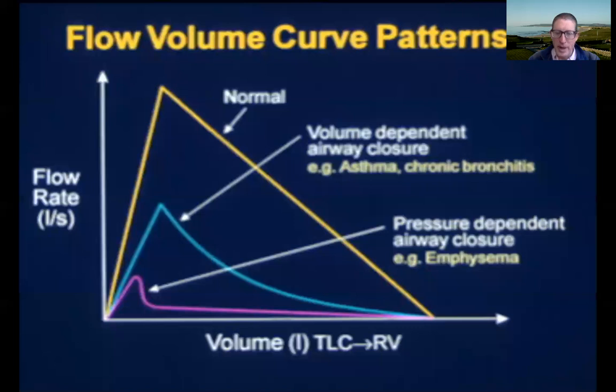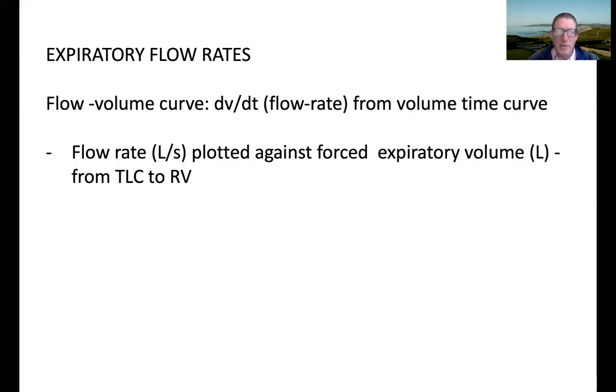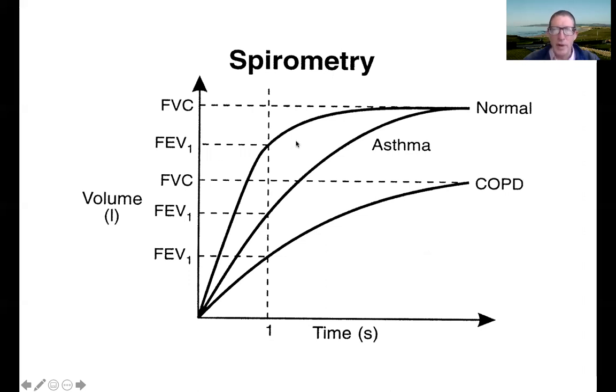The other thing I haven't told you about, let's go back to the spirometry, is a restrictive impairment of lung volumes. So if you've got restrictive lung disease, like interstitial lung disease, which Dr. Gowdy will teach you about, what happens is you get a shrunken normal spirometry curve. So it'll look something like this. It'll go like that, and then like that. So the FEV1 is reduced, and the forced vital capacity is reduced, but they're reduced in proportion to each other. So it's like a sort of a concertinaed or shrunken normal volume time curve, okay?